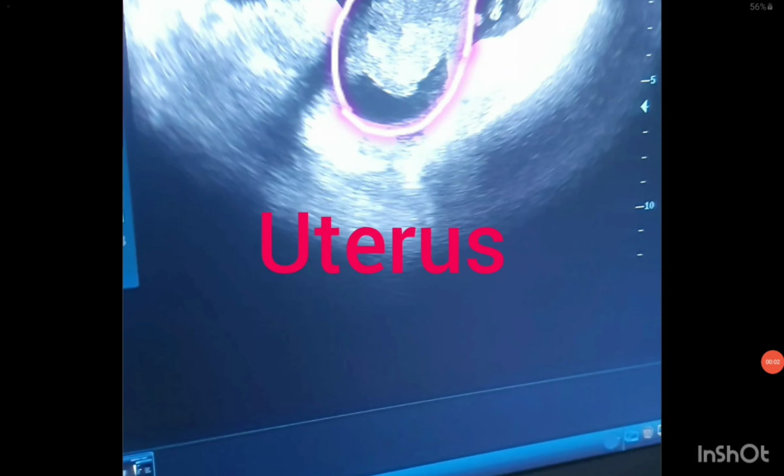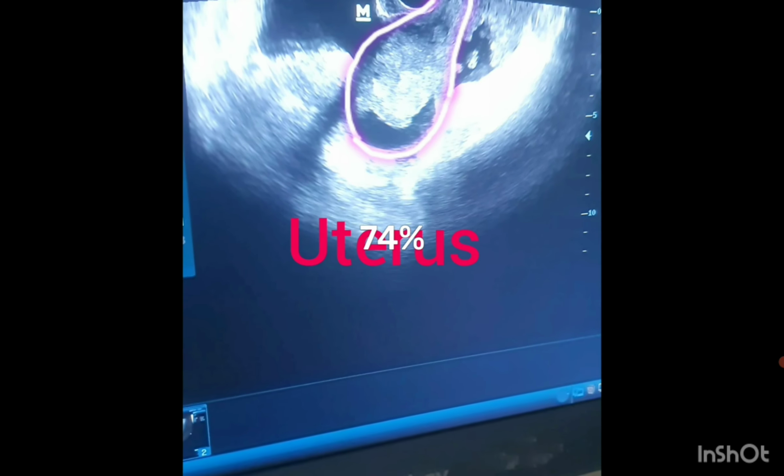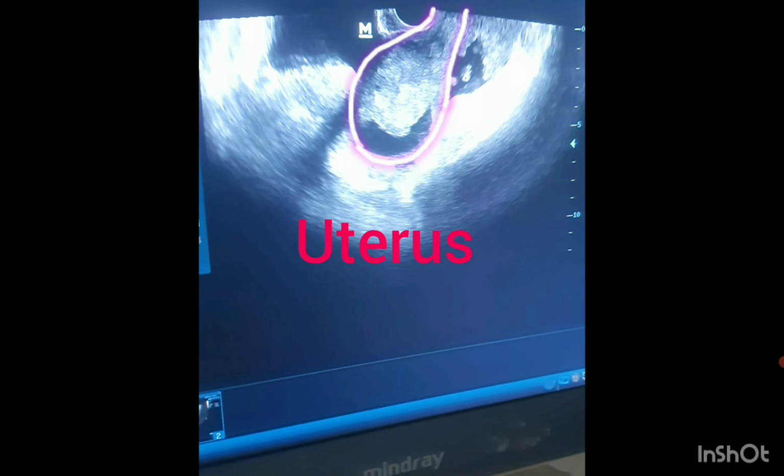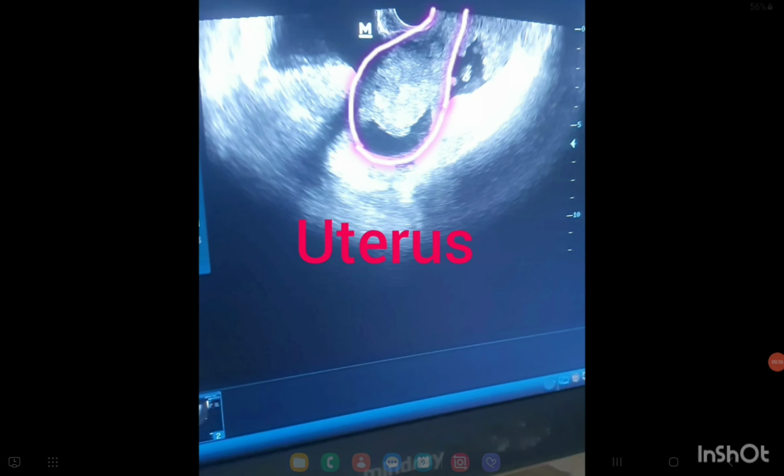Good evening everyone. Today we will discuss another case: endometrial carcinoma with an ovarian left adnexal mass. In this video I will show you how to diagnose an endometrial growth inside the uterine cavity and a left adnexal mass. Please concentrate on this video.